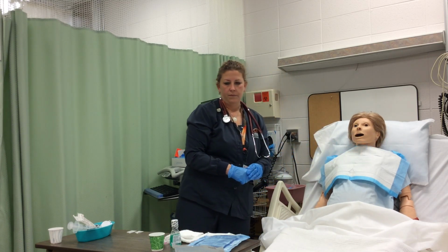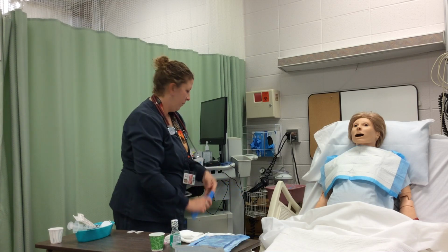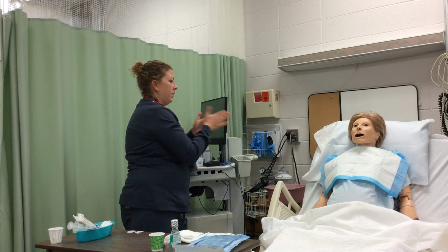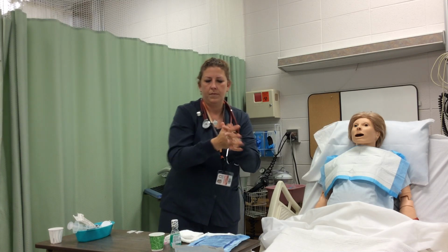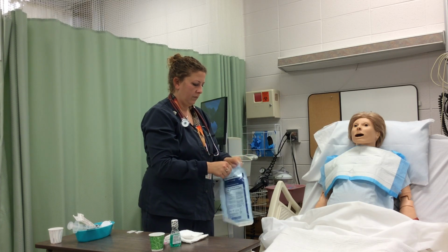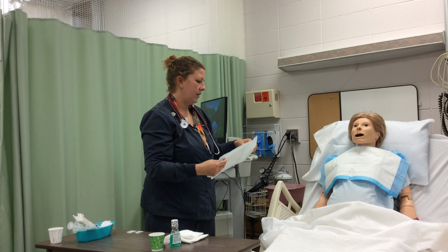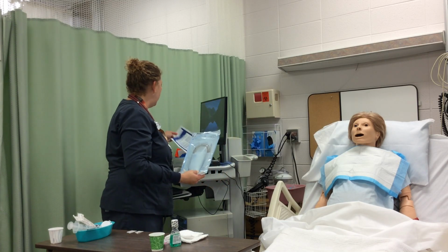To determine the length of the tube to be inserted, remember NEX: nose, earlobe, xiphoid. Measure the distance from the tip of the nose to the earlobe. I'm noting the packaging from the NG tube so that I know the size for my documentation.